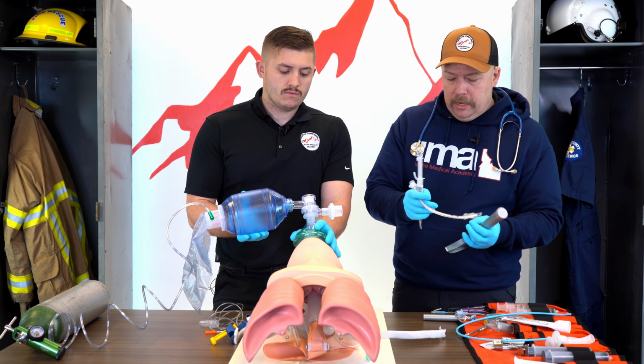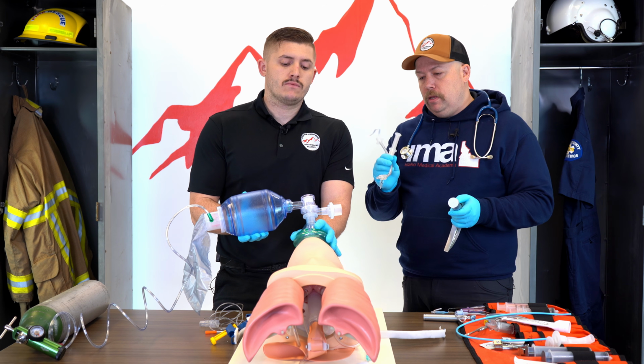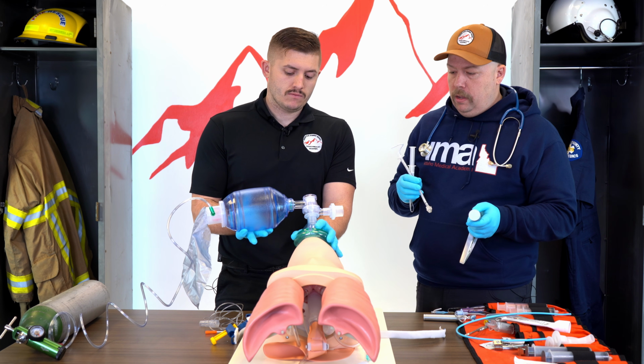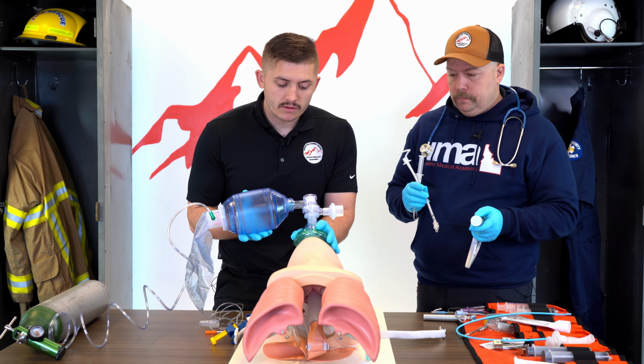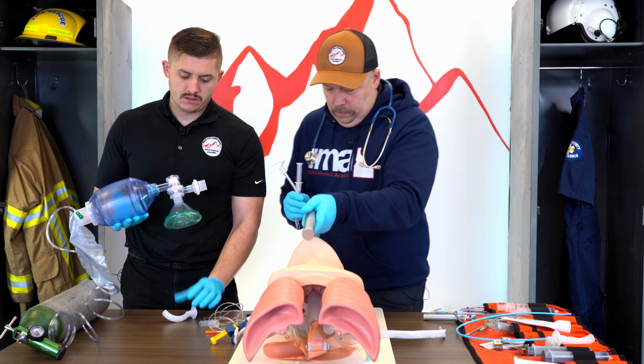So I'm already here. Cody, again, I'll have you give one more good breath, and then you'll pull the OPA out, and we'll go for the intubation. Copy that. Give my last breath right now. OPA is out. So I'm going to come here.